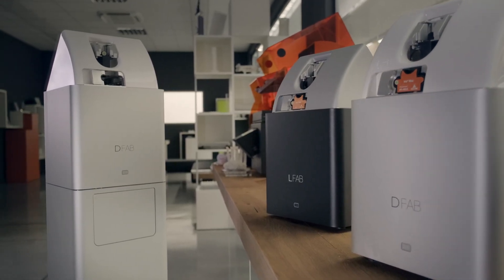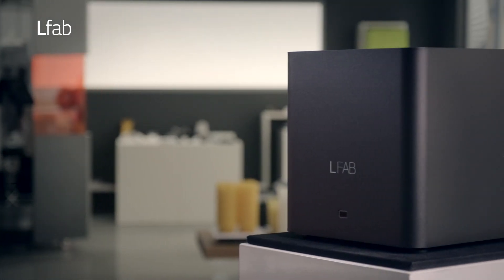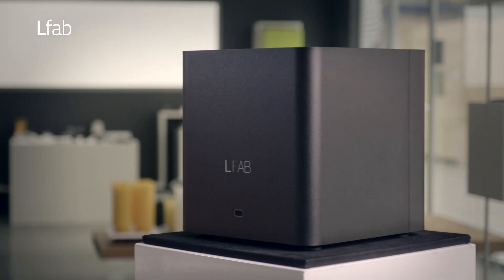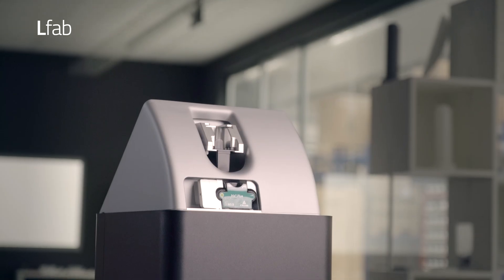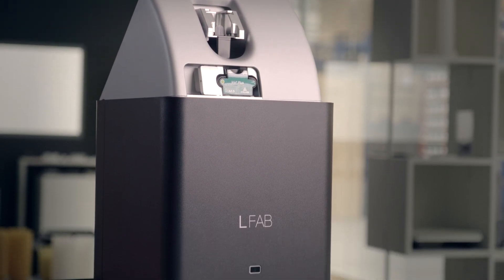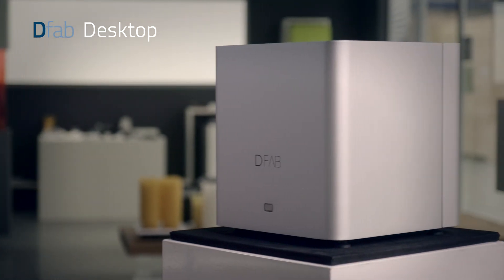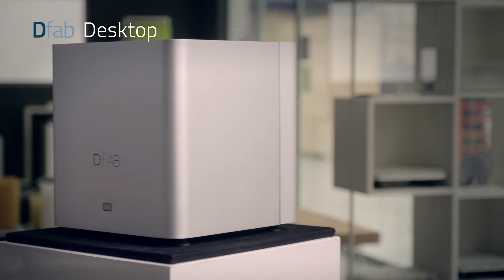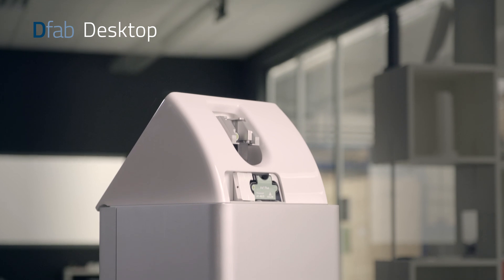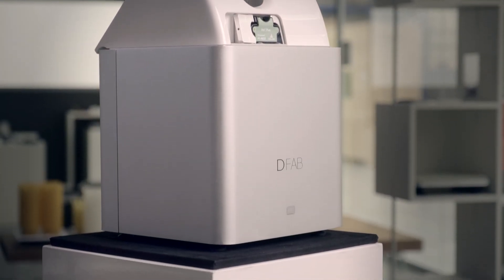D-Fab currently offers three different printer versions. L-Fab is an entry-level solution designed for dental labs and clinics that want the full functionality of a monochromatic printer, representing a sustainable level of investment for limited budgets. The compact D-Fab desktop implements Photoshade color gradient technology and requires a computer connection, easy to use thanks to the Nauta Photoshade software.